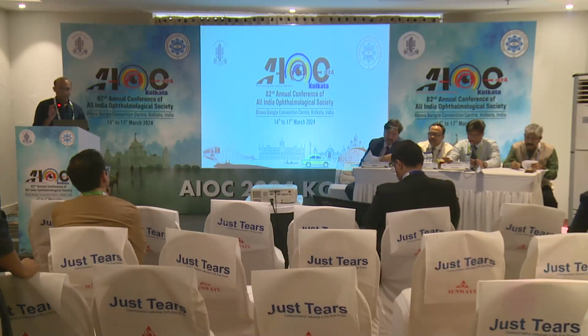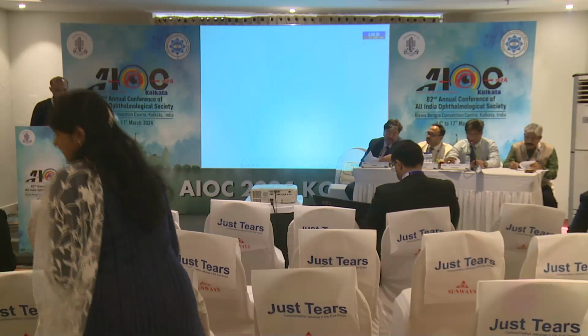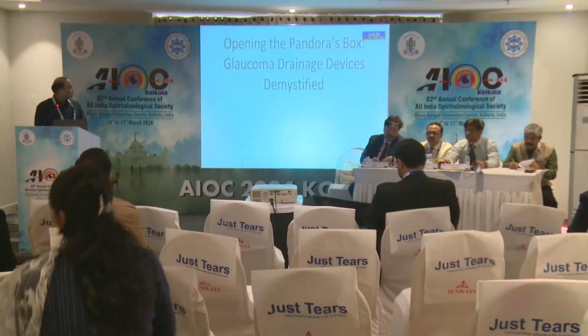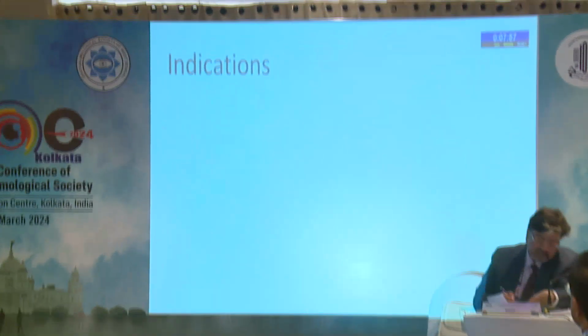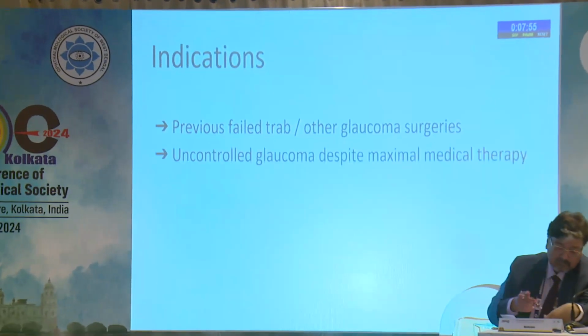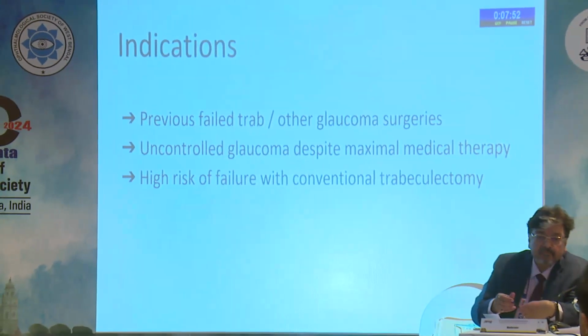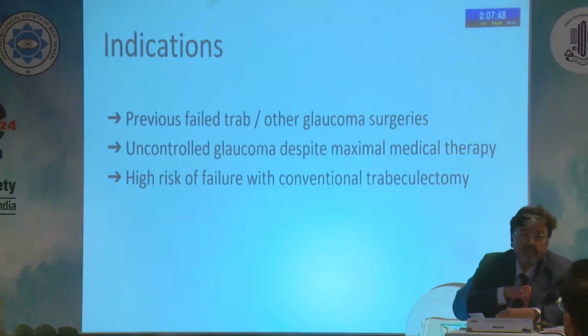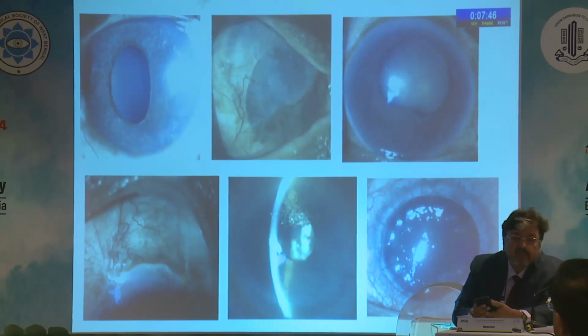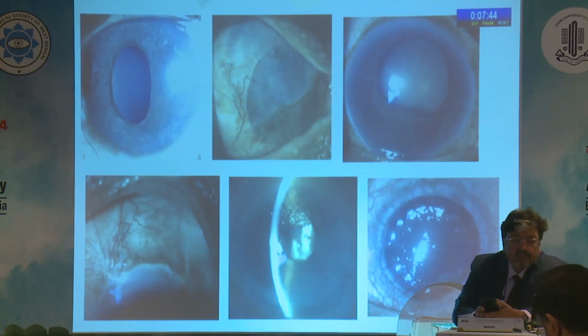Dr. Prasanna Venkatraman. Good afternoon, everyone. We will deconstruct and simplify glaucoma drainage device implantation. Though trabeculectomy is still the gold standard procedure, glaucoma drainage devices have certain clear, irreplaceable indications like ICE syndrome, glaucoma after chemical injury, corneal and vitreoretinal surgeries, failed trab, and neovascular glaucoma.